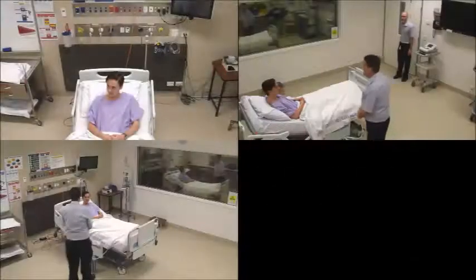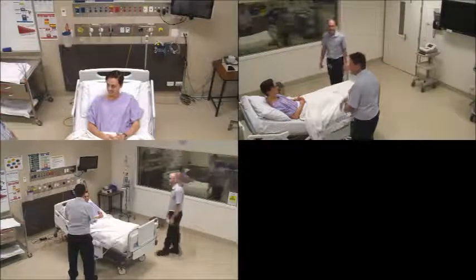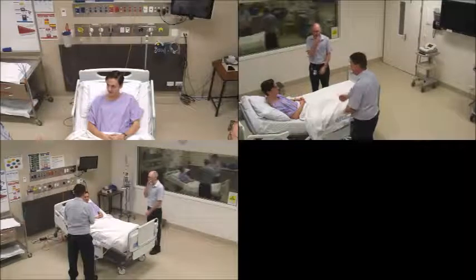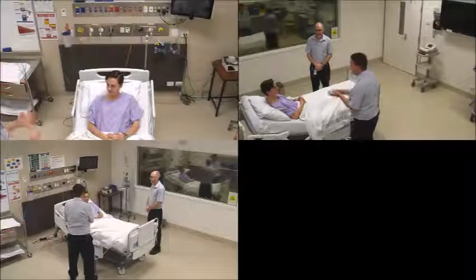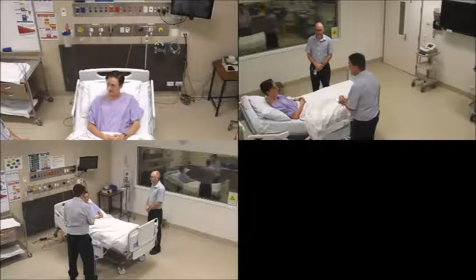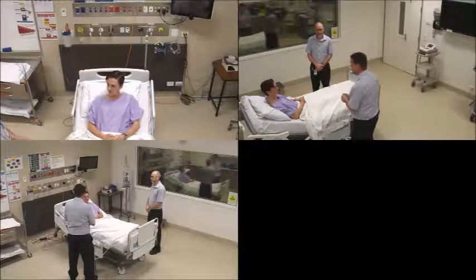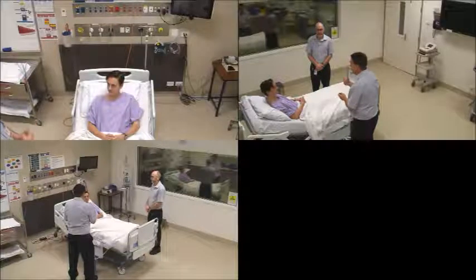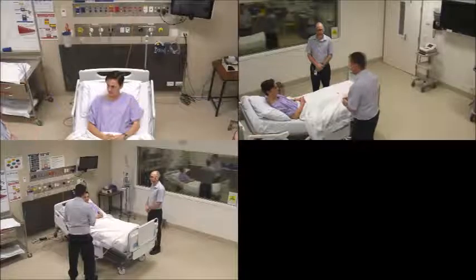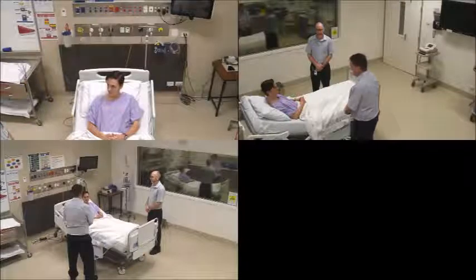Hi Scott, my name's Darren, and this is Kim, my assistant. Thanks, Scott. We have spoken with your doctors and they've asked us to come and take out your chest drain, if that's okay. There's a couple of things I need to explain before we go through the procedure. You've got your drain in place, and there's a dressing over the top. The process for it to come out is we take that dressing down and clean it with some normal saline. There's a little suture in place there. We would cut the suture, then we'll go through a breathing technique. I'll get you to take a deep breath in, hold it, and we'll take the tube out.